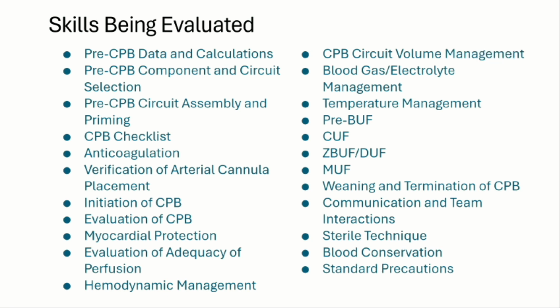And it should be everything that you do in the course of operating a case, starting from reading the case, reading the patient's chart and collecting some data, doing some calculations, using the calculations to select some components and setting up and priming the components, doing a checklist of that circuit and managing anticoagulation, et cetera, on down all the way to the end. And do you have good etiquette and do you wear your PPE and take care of yourself and others? So that's going to be the content of that.